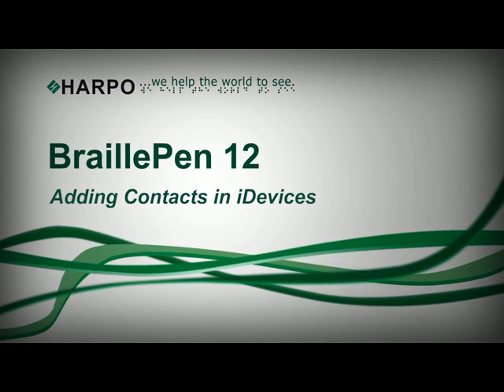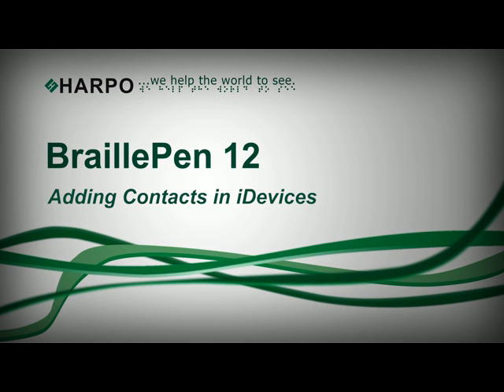BraillePen 12. Adding contacts in iDevices.